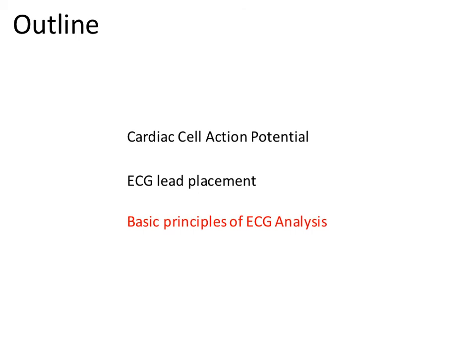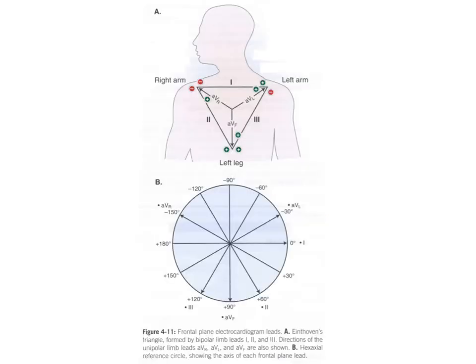Okay, now that we've gone over what a cardiac cell action potential looks like and how we place ECG leads, I hope to go over some basic principles of ECG analysis with you.